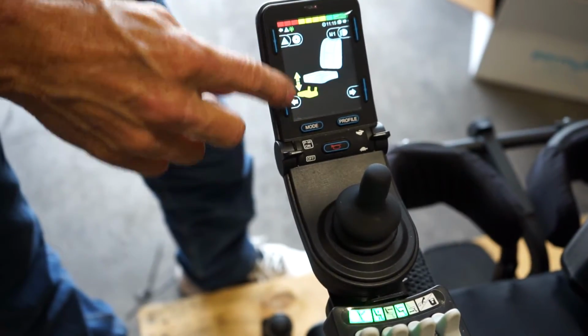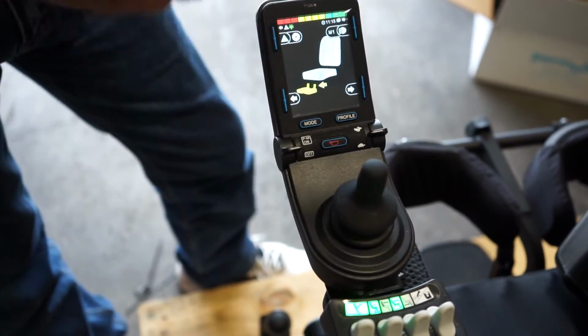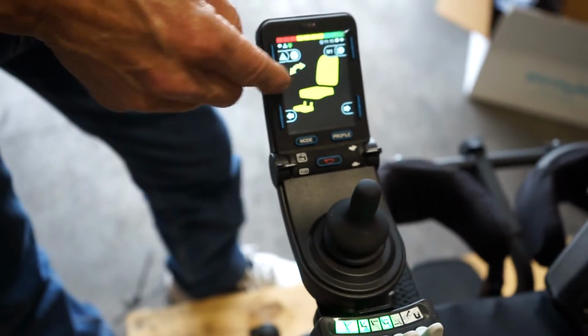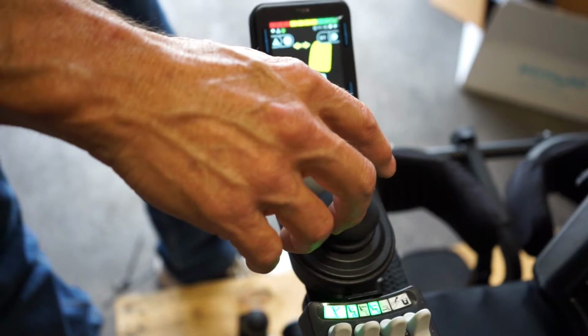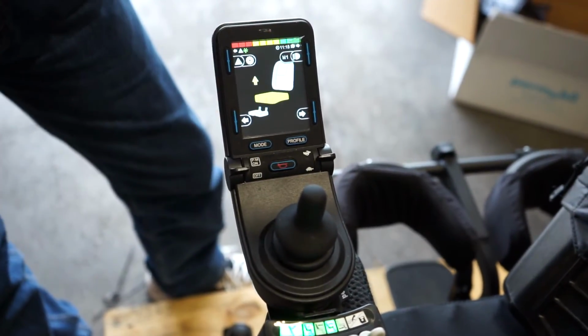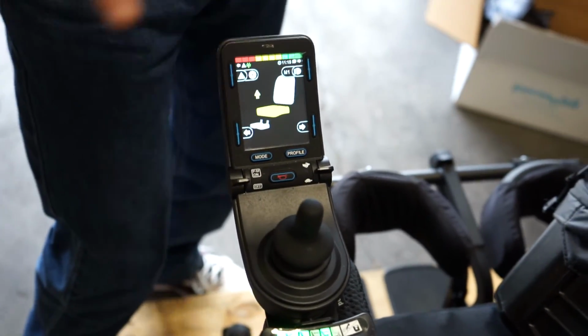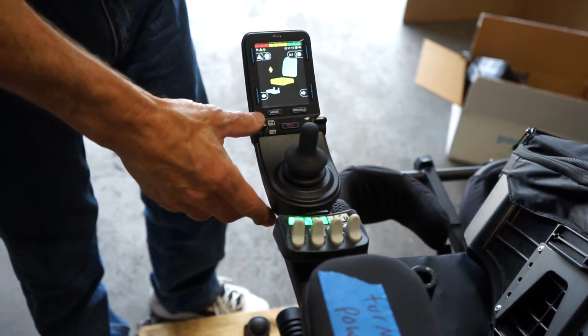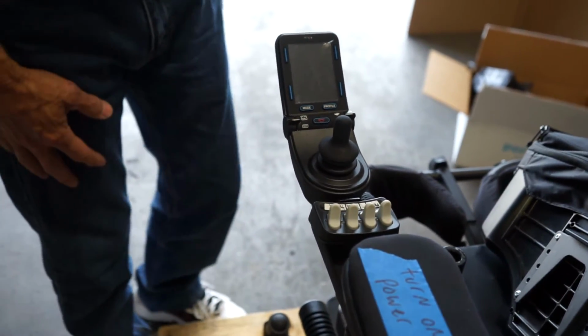Now we have the feet going up and down. We have the feet going in and out. And we had the tilting. The arrow means tilting. And this is just the back reclining. And that's just the seat lift going up. So anyway, this is just a quick heads up on the chair, and when you shut it off, just push the button back and you're off.